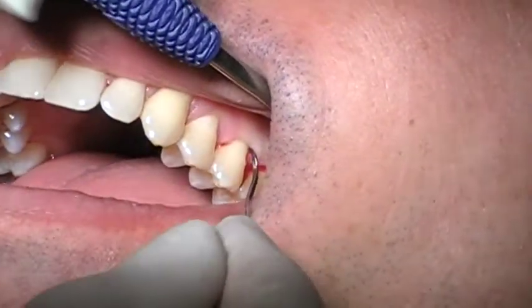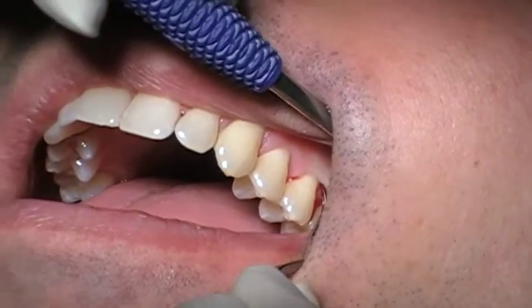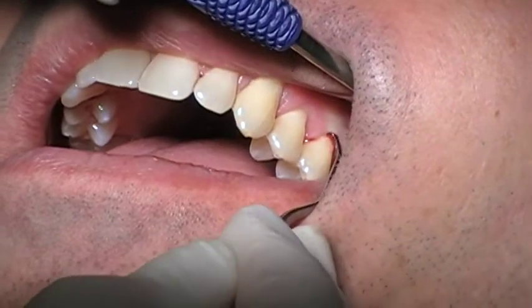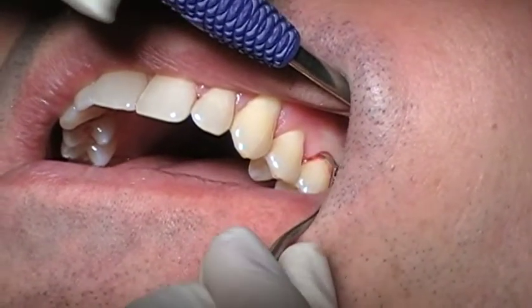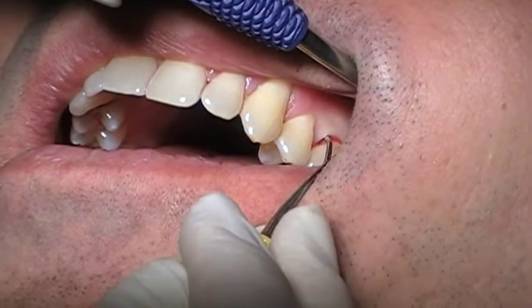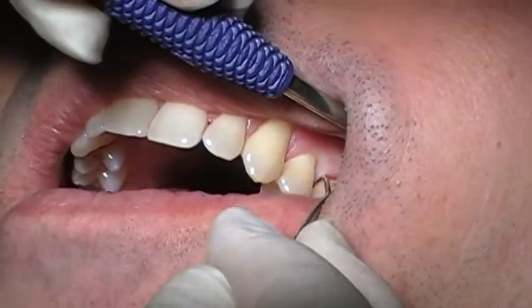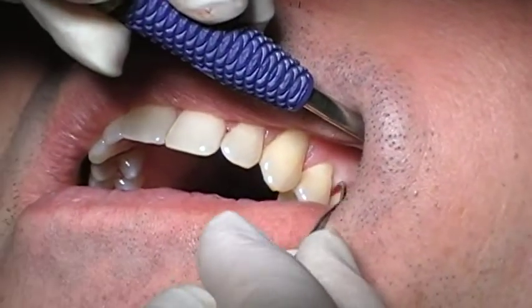Distal line angle insertion, zero degrees. Mini walk into it, and as I come at the mesial line angle, I roll it into the interproximal, back into the col area, and smooth up any deposits.